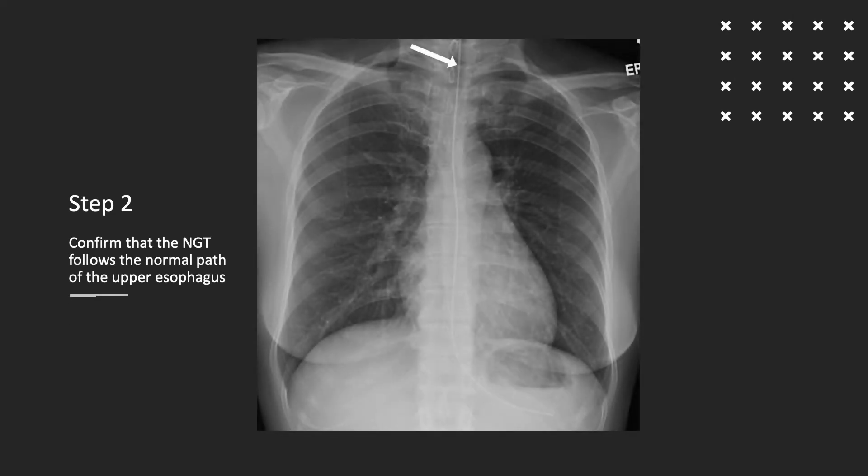Follow the path of the nasogastric tube in the upper thorax and confirm the tube passes vertically in the midline, overall slightly to the left of the trachea, and then adjacent and immediately to the right of the aortic knuckle.